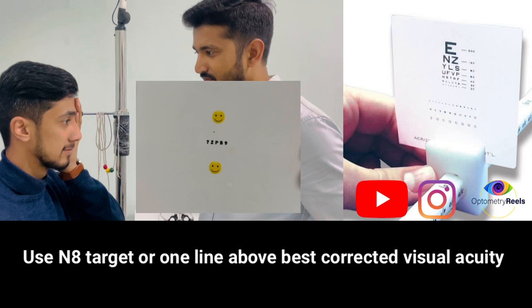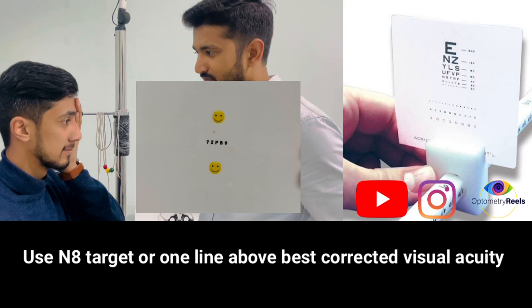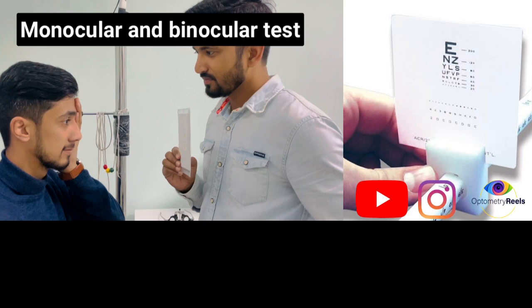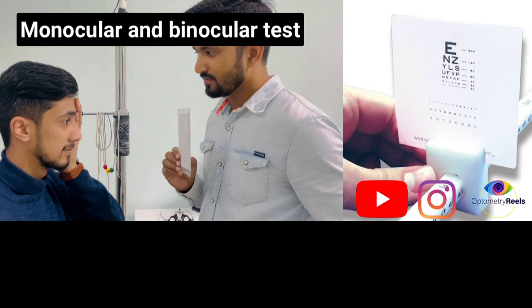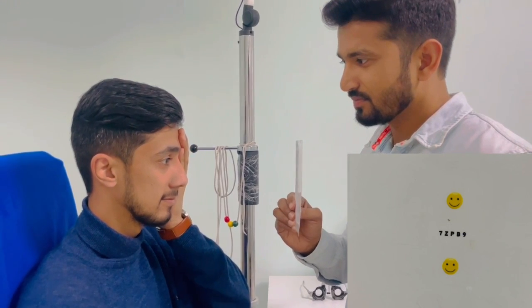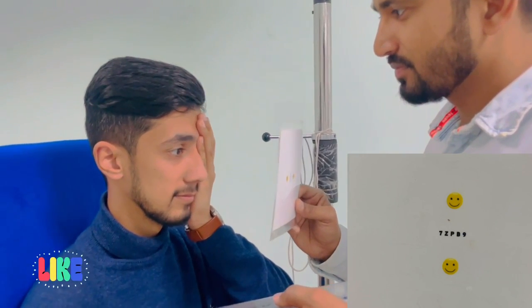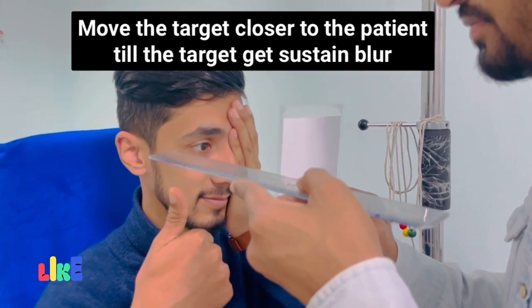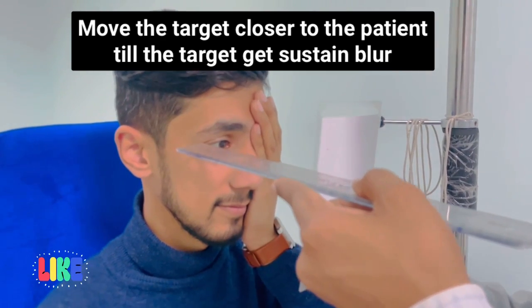Usually any target one line above best corrected visual acuity is asked to read — first monocularly and then binocularly — to ensure the blur point. You just have to bring the target closer to the patient's eye and insist they read and observe the sustained blur, meaning the distance after which they are not able to clear the target even after full effort.